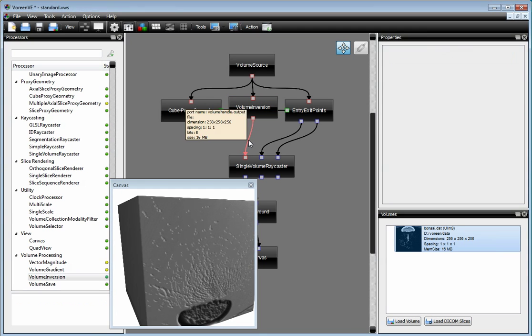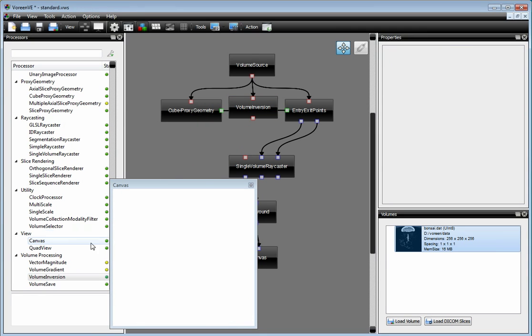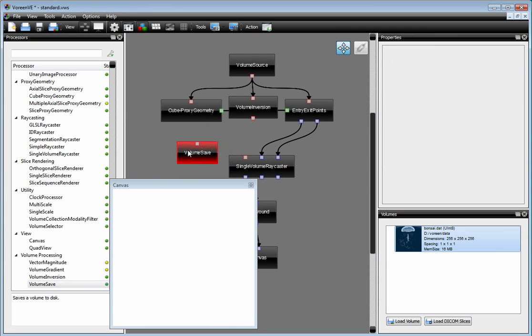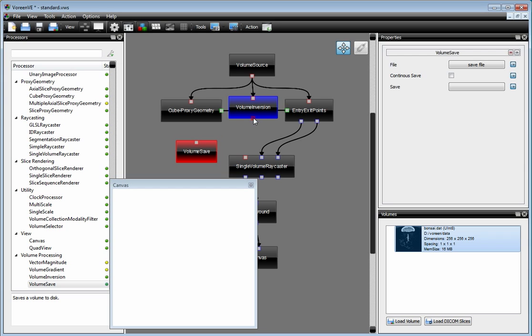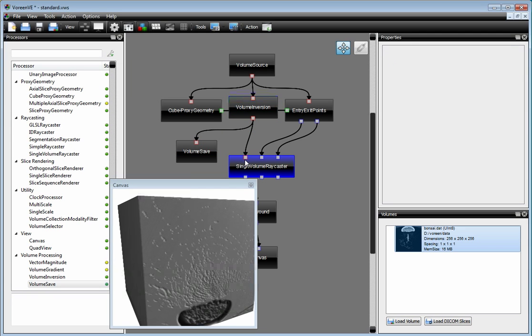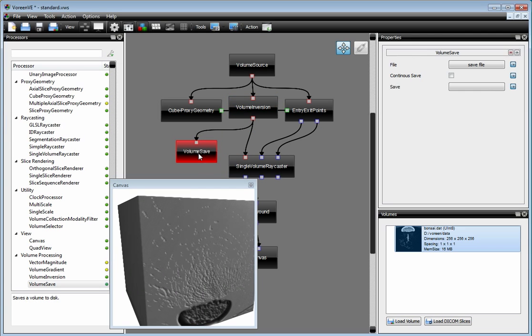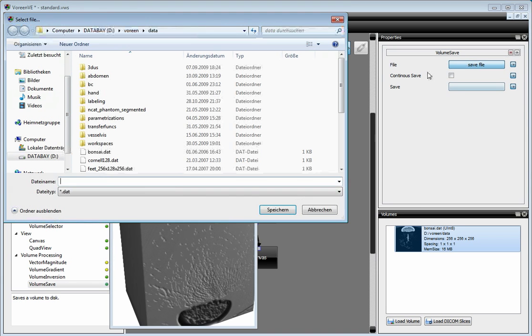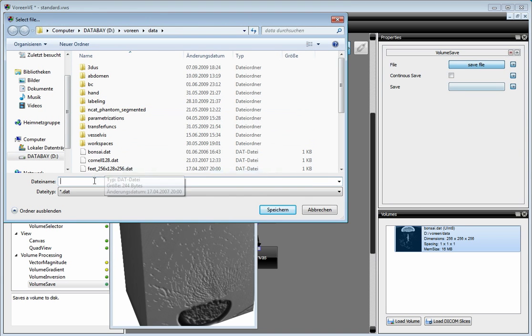If you would like to save this inverted dataset, you can use the volume save processor. Just drag it into the network and connect it here. And you still can connect it to the output. And then you can save this one wherever you would like.